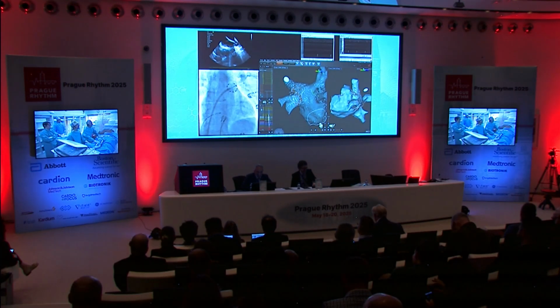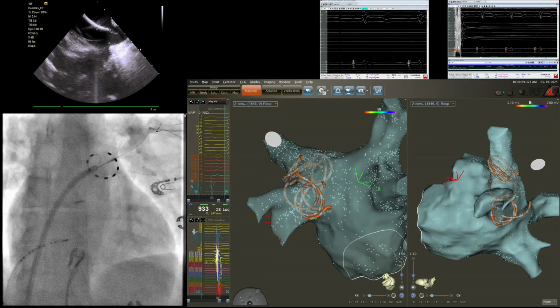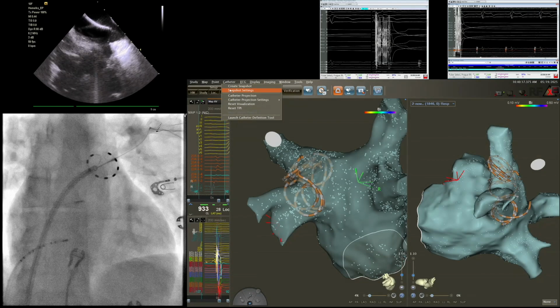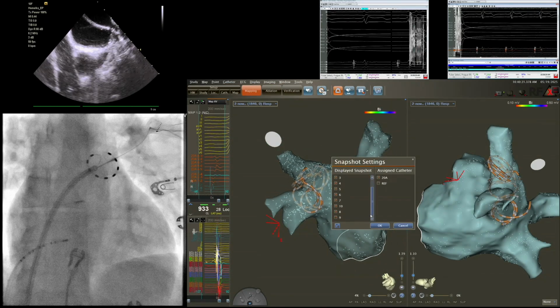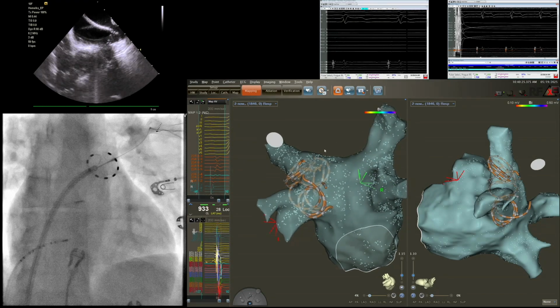Okay, rotation. Perfect. Okay, let's go. I like this more. Okay, go. Shadow. Okay, perfect. Okay, so now we are ready to move. We have 8. Yes, perfect. Okay, so let's move to right upper.